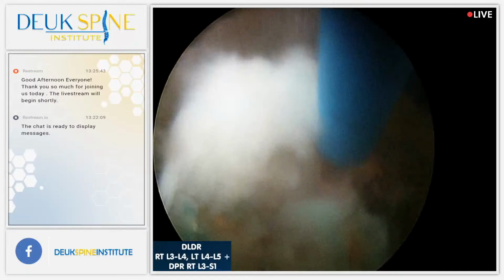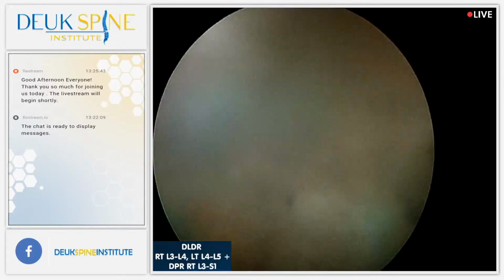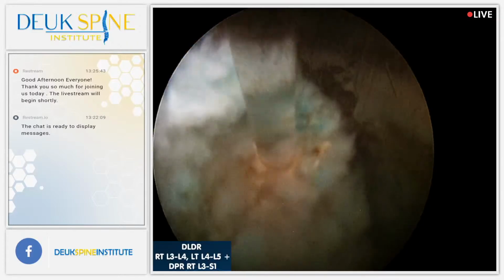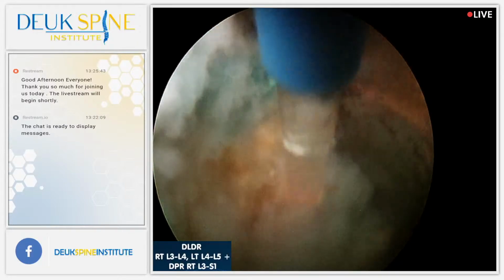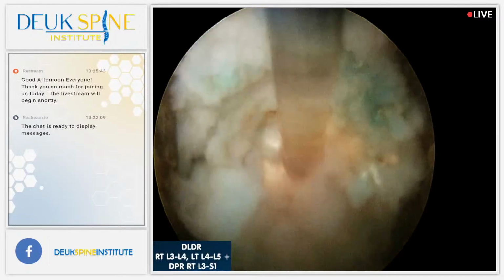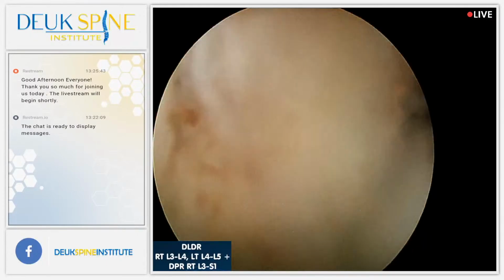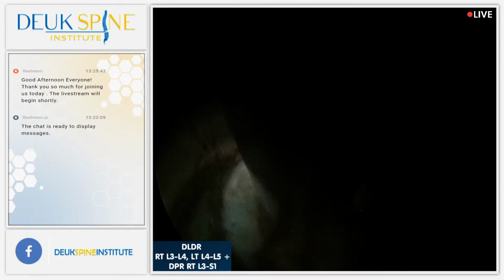A fusion stops discogenic pain because you usually have to clean the disc out when you do a fusion. So it's not all fusions, it's really interbody fusions with interbody cages at the symptomatic disc. Other types of fusions may not work because they're not really treating the source of pain. All of this white stuff here is scar tissue. This is all damaged disc and herniation. All right. If we don't have any questions, let's move on to how we fix the disc without having to do fusion.